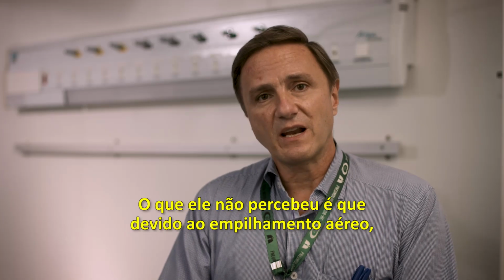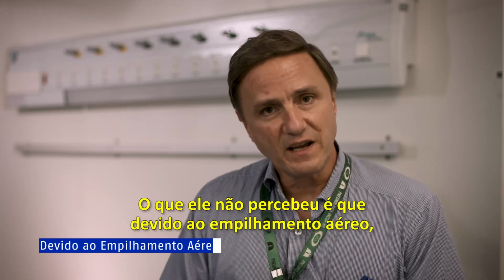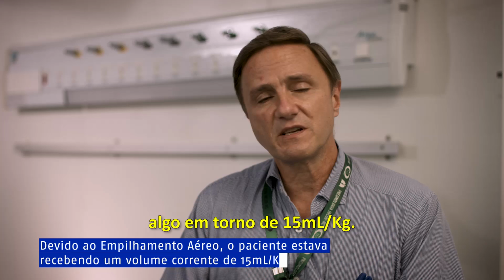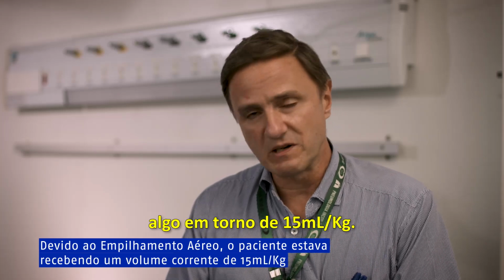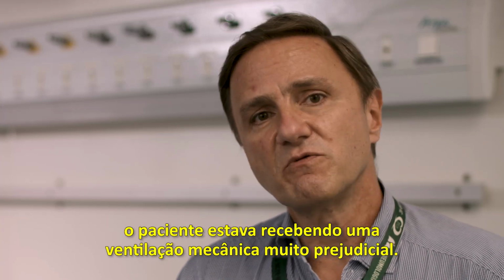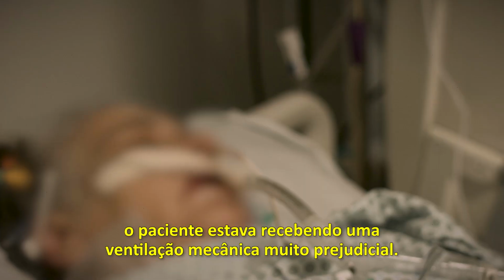What he didn't realize is that due to breath stacking, the patient was receiving a much larger tidal volume, something around 15 mL per kilogram. So instead of receiving a protective ventilation, he was receiving a very harmful mechanical ventilation.